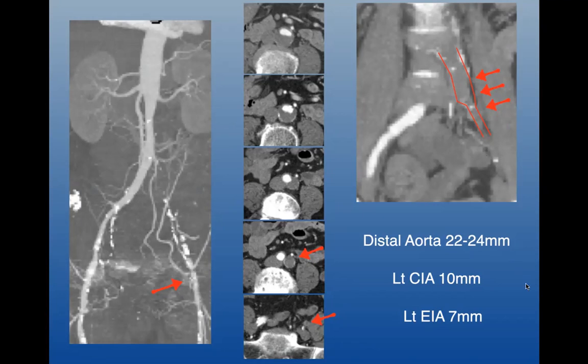And, you know, we can have a long discussion of whether you use uncovered stents or covered stents. But I think in general, most people would say from the data that most people would use balloon expandable stents in the common iliac arteries and self-expanding stents in the external. If you think of the external, it kind of dives down into the pelvis before it comes up to basically transition into the common femoral artery. And so by putting in balloon expandable stents in that area, there's always a risk of rupture. And that's what you worry about with any external iliac artery.